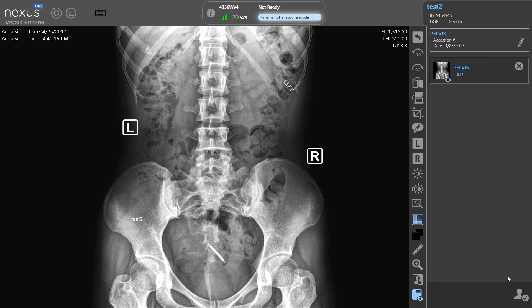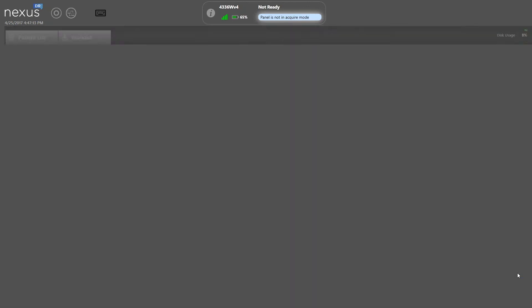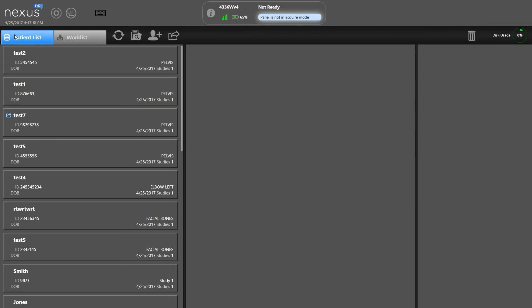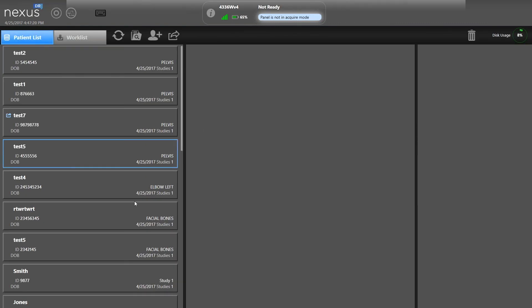When you've made your changes and you're satisfied with the image, simply click on Close Patient. It will ask you if you want to suspend this study since we have some work to do still, or we can close the study. Once we've closed the study, we go back to our original worklist screen and we're ready to move on to the next patient.